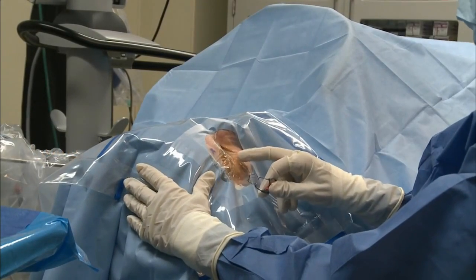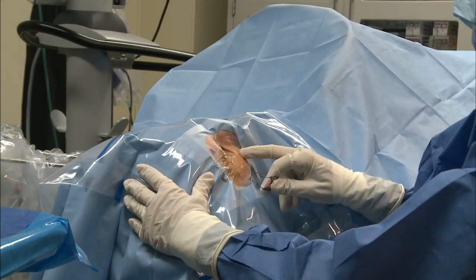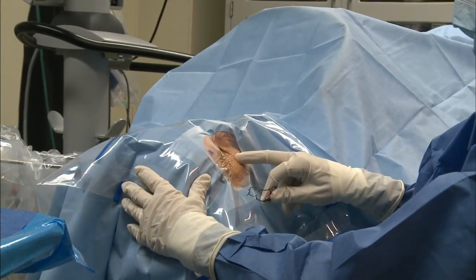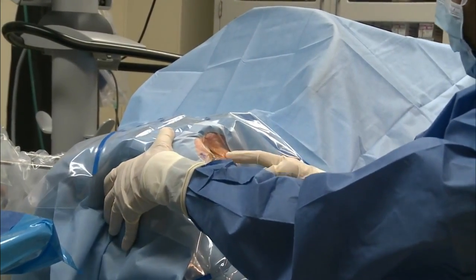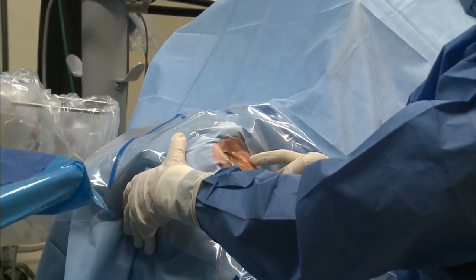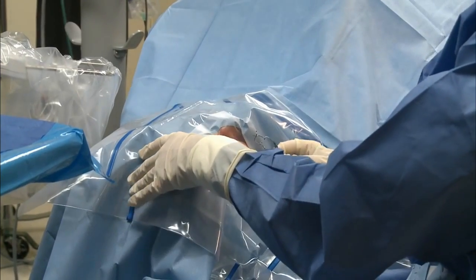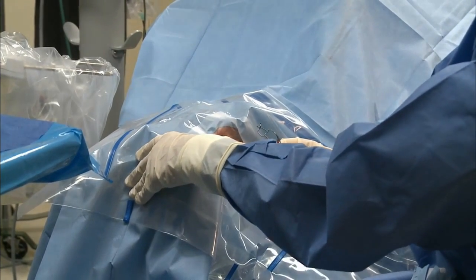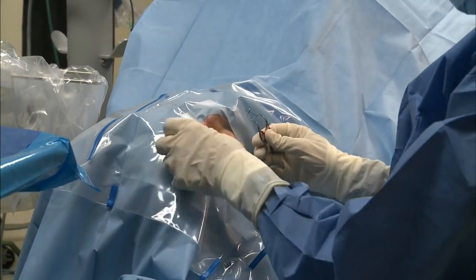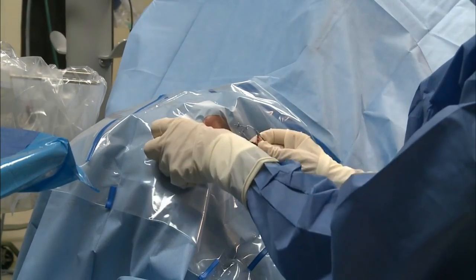So this patient has a very deep set eye, and really it's deep set because the brow is elevated. Down here she's not so deep set, so we're going to tilt her head down. So let's do that. So into a Trendelenburg position we go. Good. Now just take the table up a little bit. So this will dramatically improve the access of my left hand instrument to the eyeball.